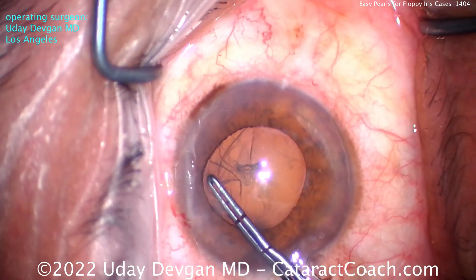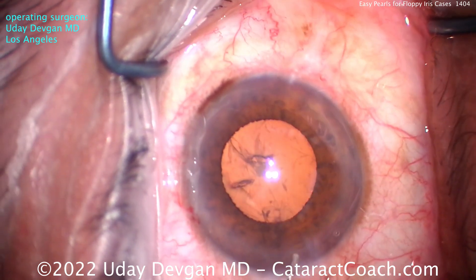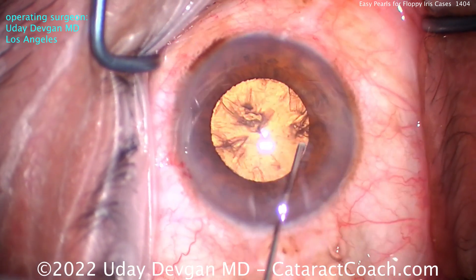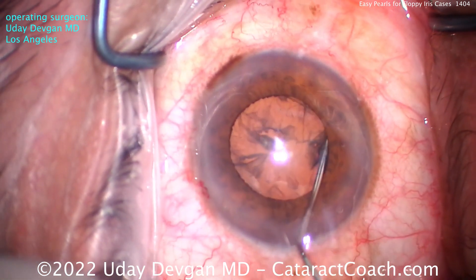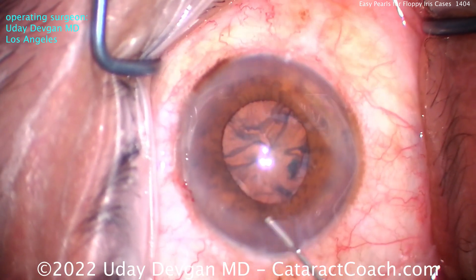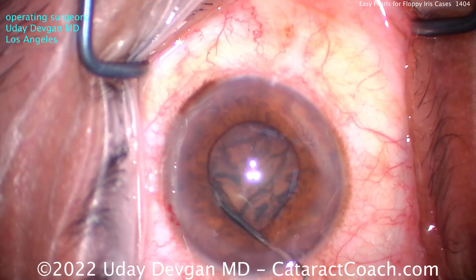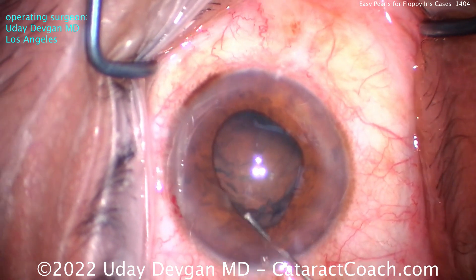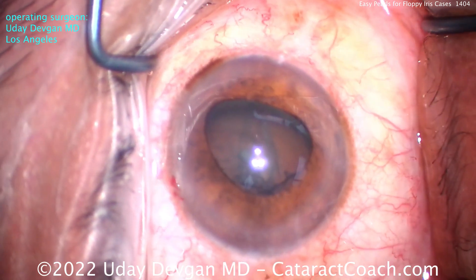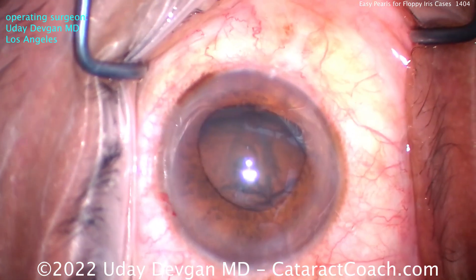It is 5mm now — I assure you this case will end up with a much smaller pupil, but it's not going to be an issue for us. Key here is nice and gentle hydrodissection. Get that fluid wave across and I want this nucleus partially tilted out of the capsular bag. The iris wants to prolapse — we've got to be careful. Decompress it, get rid of that pressure gradient, don't let it prolapse out of the eye. Now you can see that's the lens equator — we're going to use the iris to actually hold the nucleus. A little more viscoelastic to protect the cornea and give you a little more room.